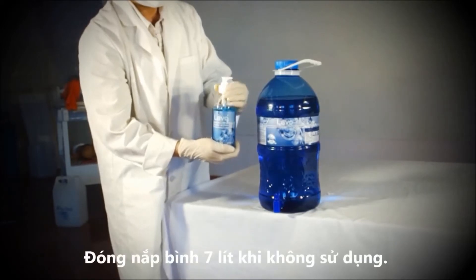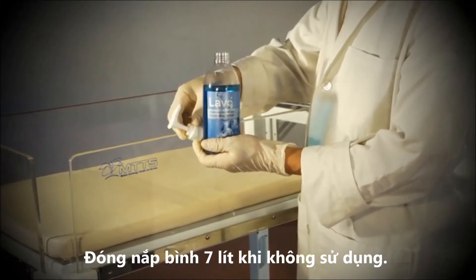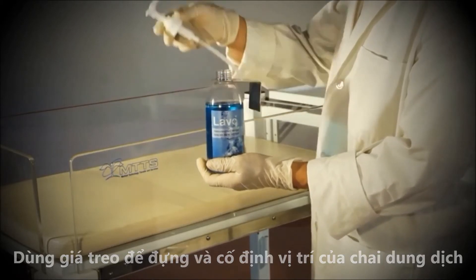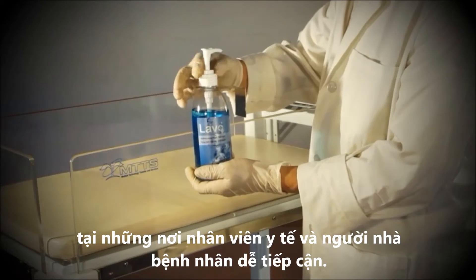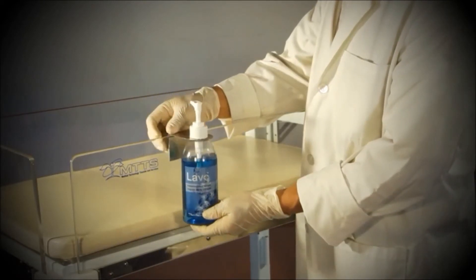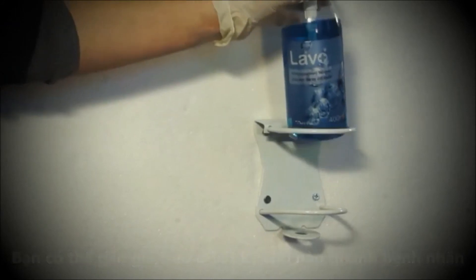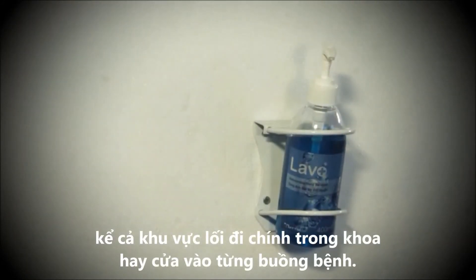Close the 7 litre container when not in use. Use the portable bottle hanger to hang the dispenser bottles in a place where they can be easily accessed by staff and visitors. The wall hangers can be put anywhere babies are being treated, including the entrance to the unit and all entryways inside the unit.